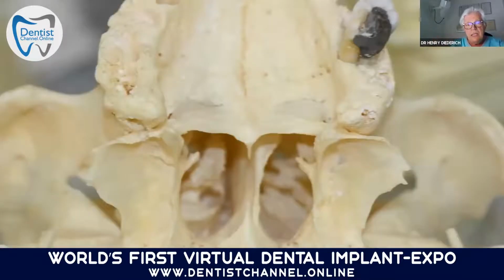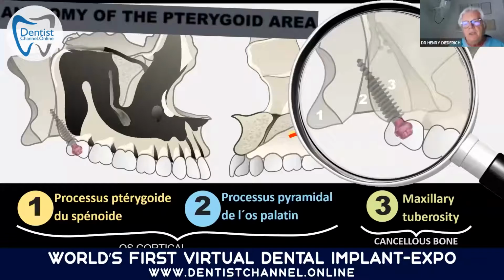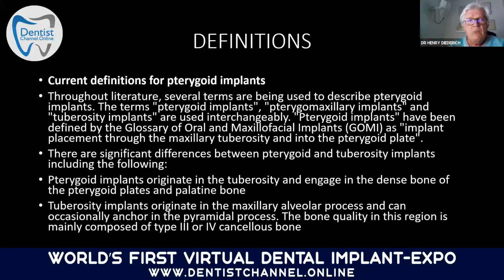Here you see a posterior view of the maxillary tuberosity with the wings of the sphenoid, which is our cortical area of the pterygoid. And then here you see on the right side the fixation of this pterygoid implant, which anchors in the cortical bone and which is anchored in the pyramidal bone and in the wing of the sphenoid, which is our pterygoid. So we have current definitions of pterygoid implants.